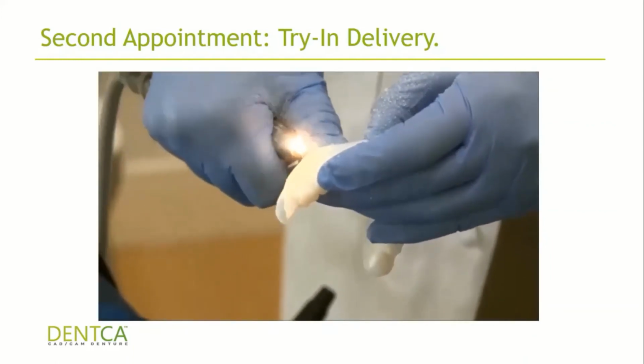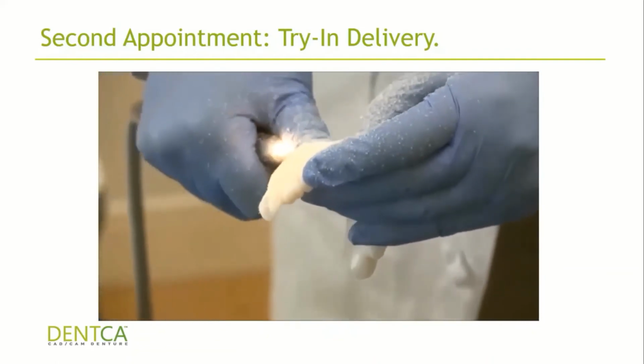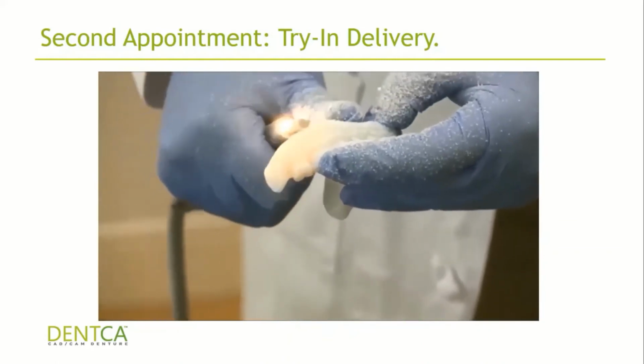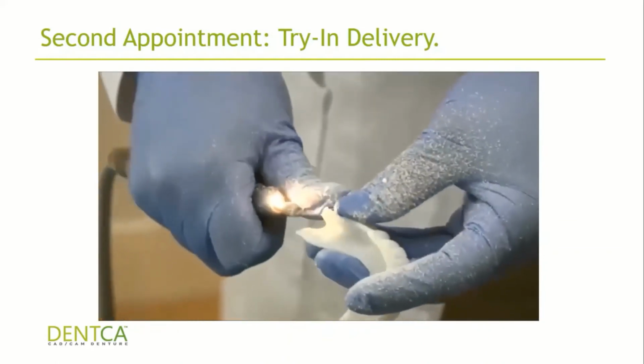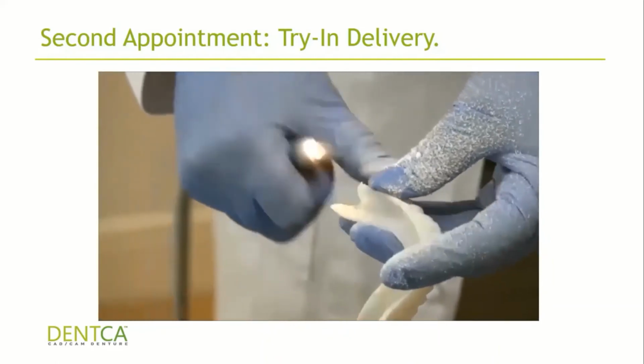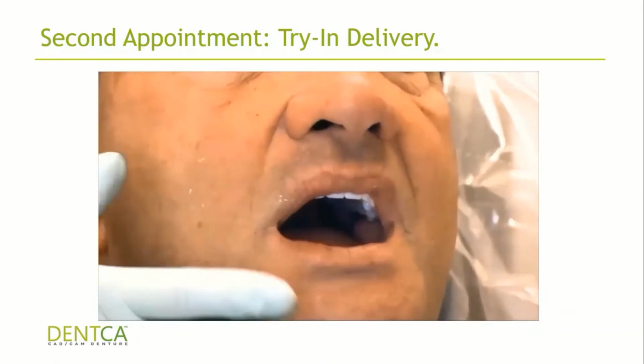And to grind them, you just do it with an acrylic burr. I've seen some people even use the big motors for polishing, and they put special burrs in there. You can do that, but you're risking it goes too fast and it's too aggressive, so you're risking over grinding it. So you want to keep it as close as possible, and then they basically do a wash.